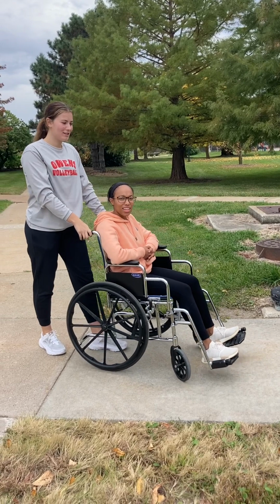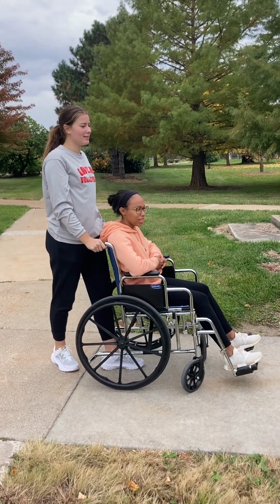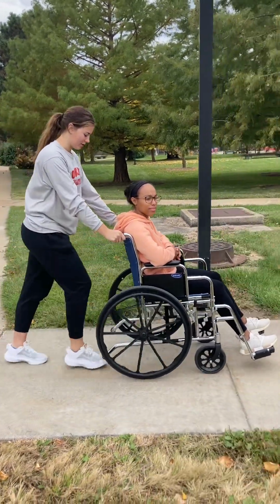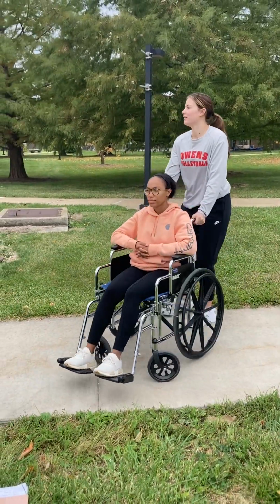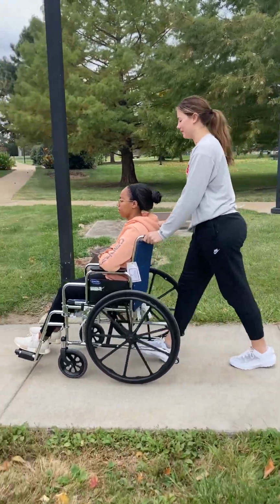So now we're going to do inclines and slopes. So first is assisted ascending a slope. Just make sure all four wheels are on the ground. Up, and then to descend a slope, push down, and you push them down the slope.